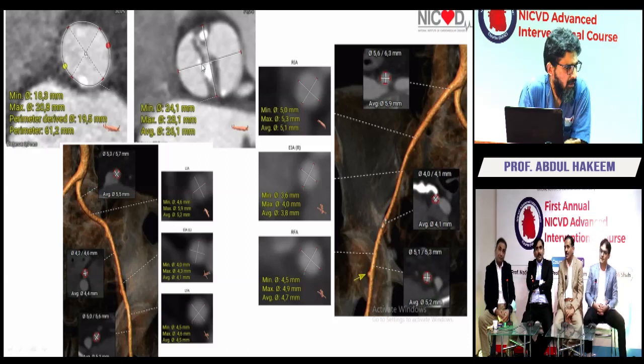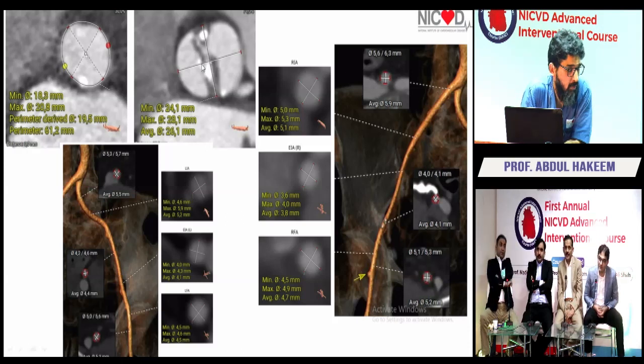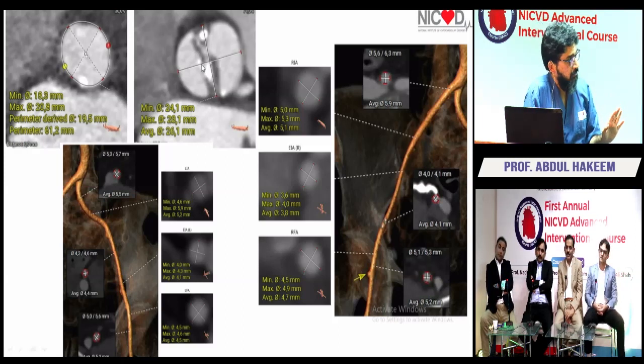Okay, so I'll tell you, in my previous life, our go-to approach was subclavian. But we didn't do it fully percutaneous. Had the surgeon do an arteriotomy, put a graft, and we did it through that. 6% risk of stroke. No, but I'll tell you, in well over 24 cases, 0 strokes. But it wasn't fully transcutaneous. You see what I'm saying? The surgeon exposed the artery, did an arteriotomy, put a temporary graft through which we put the sheath in, did the procedure, and then came out.